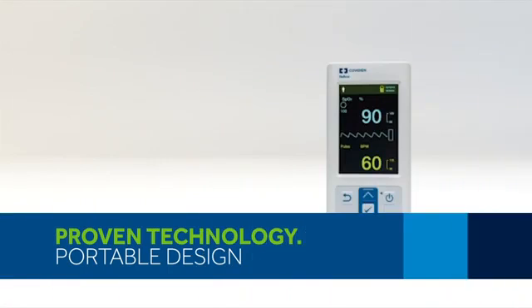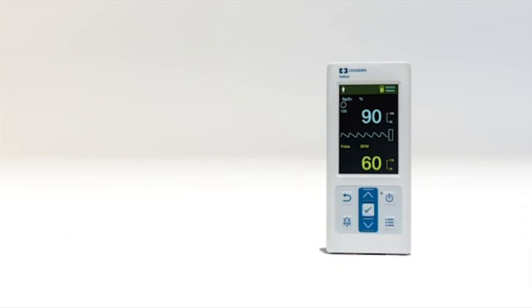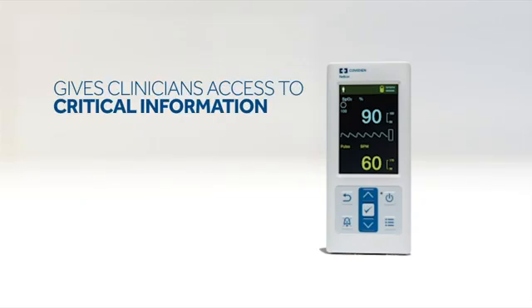The Nellcor Portable SpO2 Patient Monitoring System, PM10N, effectively monitors a broad range of patients across multiple care areas. The PM10N is a convenient handheld monitor intended for spot checks or continuous monitoring in the hospital environment, in the home, and for mobile use.